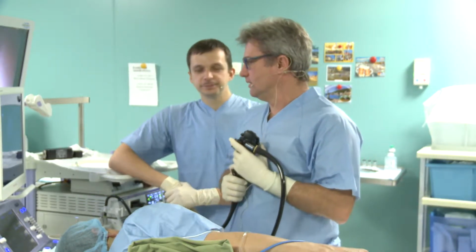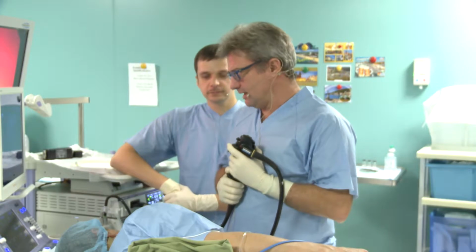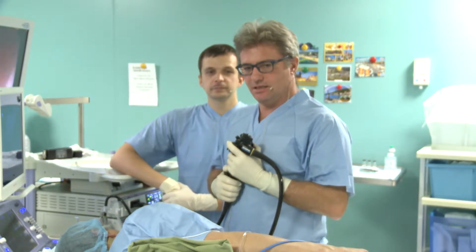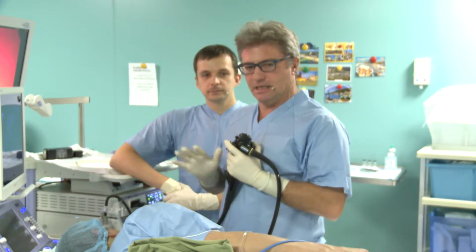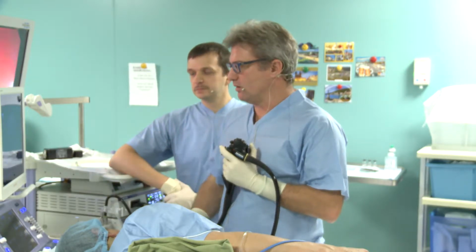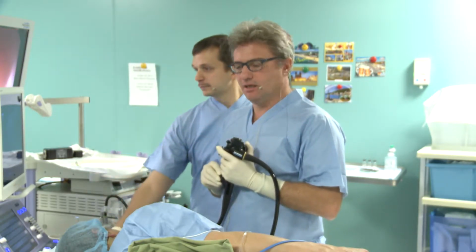Welcome back. So I have to thank the team, the anesthesiologist and the nurse for the good job they have done. So the patient had acute pancreatitis 2 months ago, and he has a CT done 2 months ago that shows a lesion in the body of the pancreas. So we're going to start the examination from the duodenum. We are already down into the duodenum. We fill up the duodenum with water. If you can give me the US image.